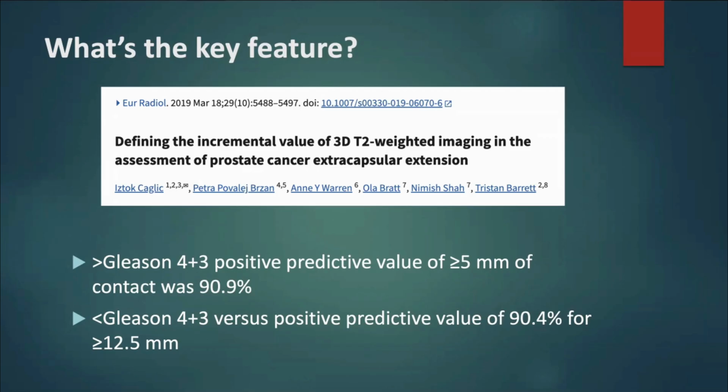And I think that's particularly important when you incorporate that with other factors that we can interpret, so the pathology, PSA density, or the PIRADS score. And those are all variables that we can easily interpret and help to predict extraprostatic extension. And then using those MRI images, we can then hopefully inform surgical margin or surgical approach.